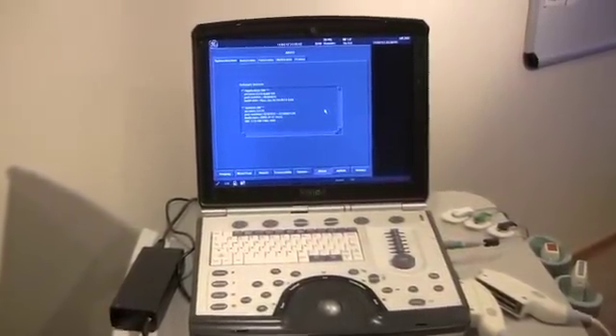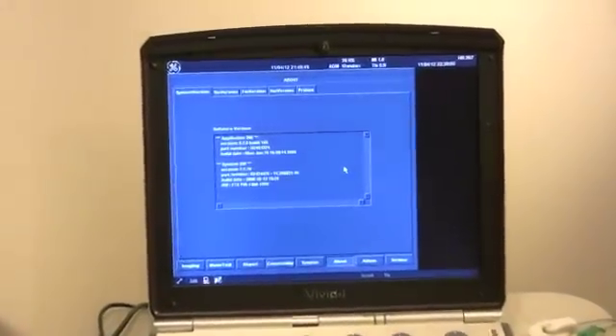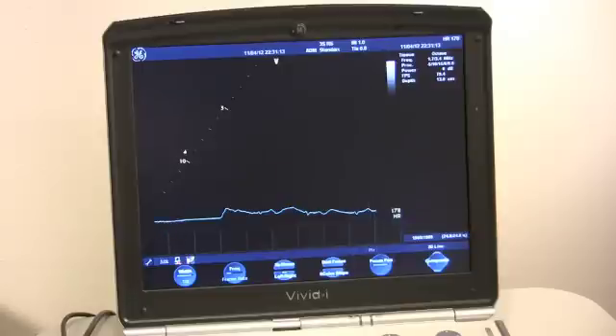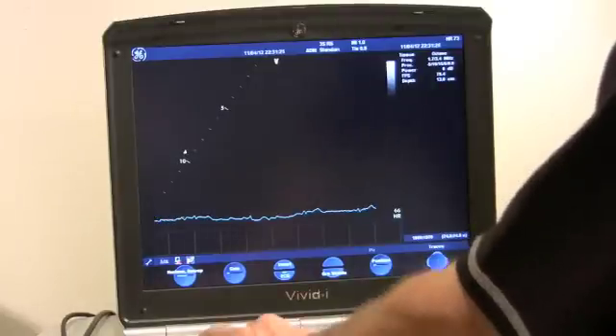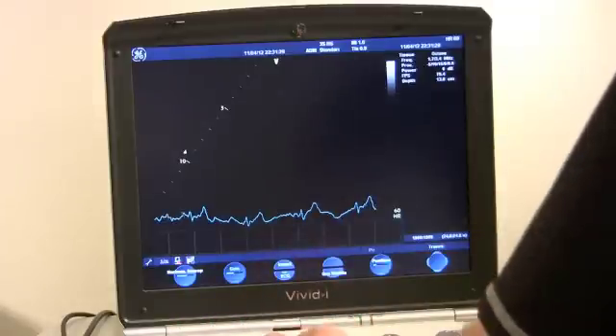I'm going to bring it in on the screen here a little bit so that you can see that the system works. There you go, and we should have an EKG signal — and we do. Let's increase the gain on that a little bit so that you can get a little bit better view of it.